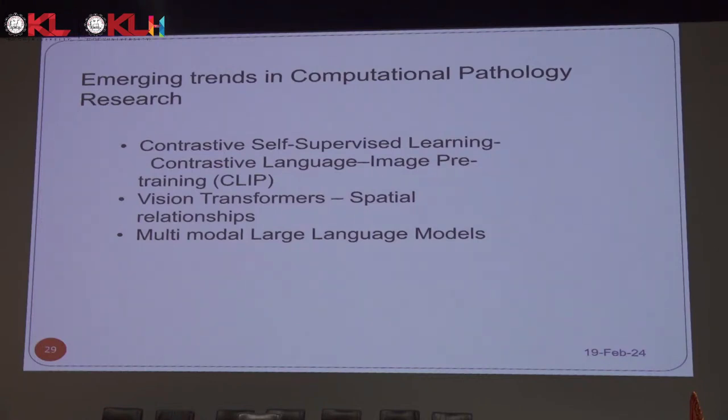Another important development that's happening is, instead of handcrafted annotation, given that pathologists' time is very critical, can we look at medical records? Now that we have LLMs, we can map text to images. Can we look at the descriptions in the diagnostic reports and use that to create images to do the annotation?